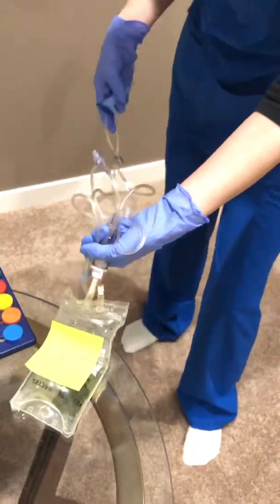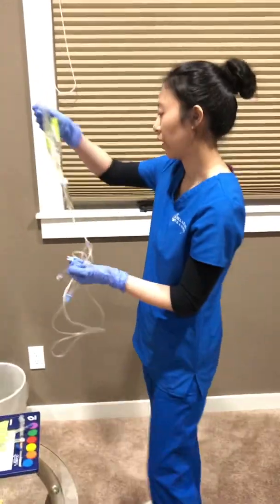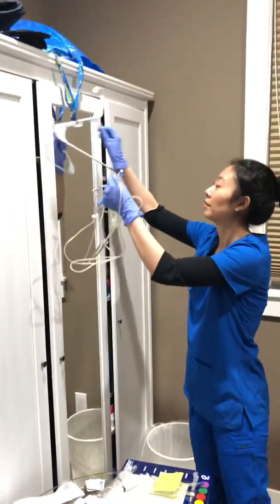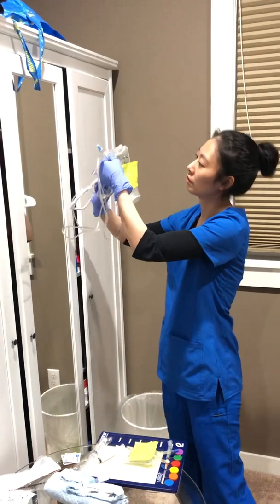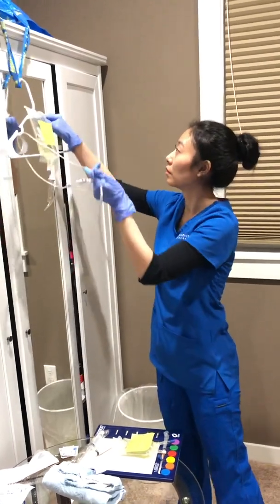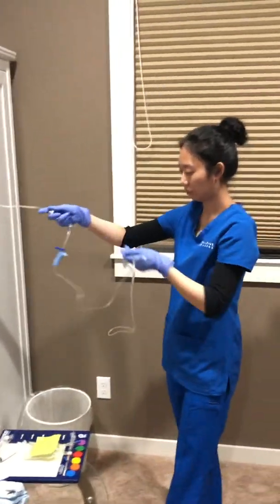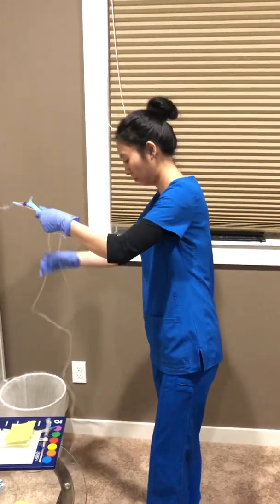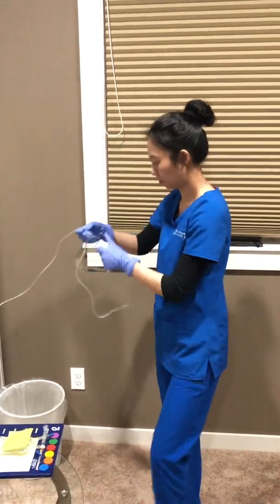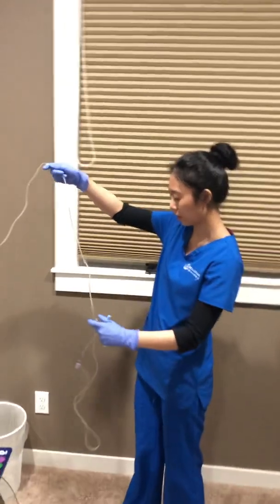And I make sure I clamp it so the medication is not dropping. Hang it. Make sure the IV line is not kinked.